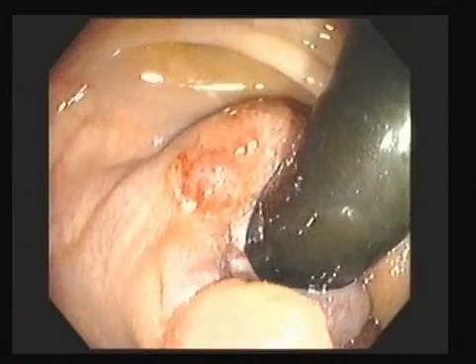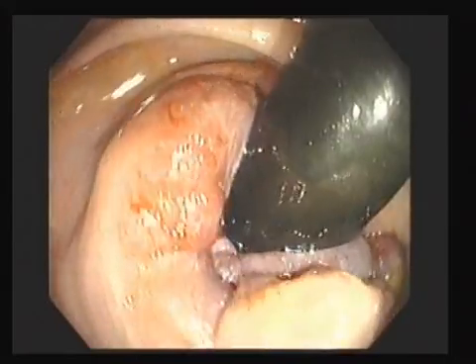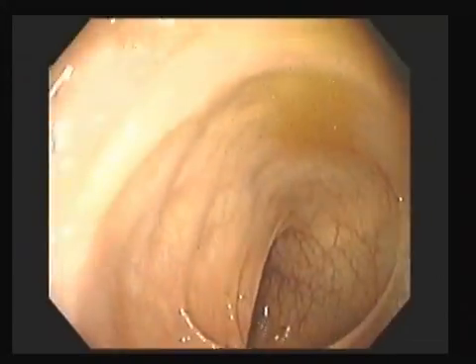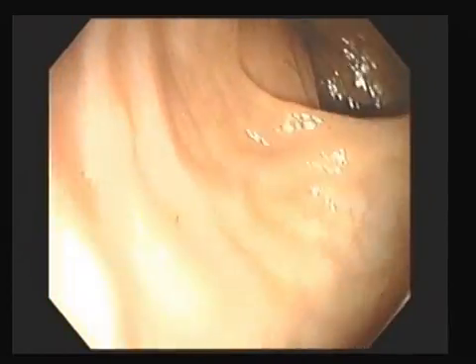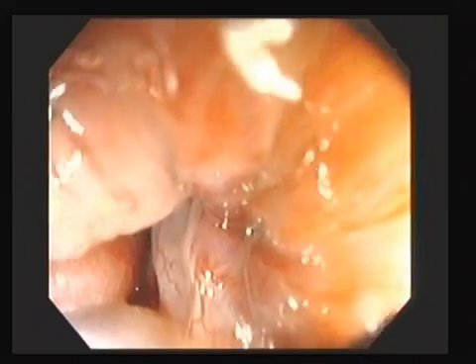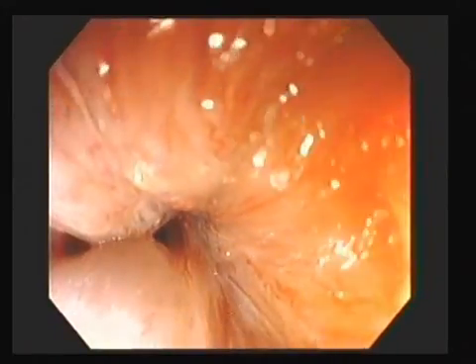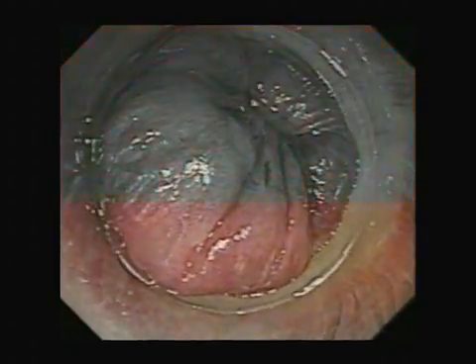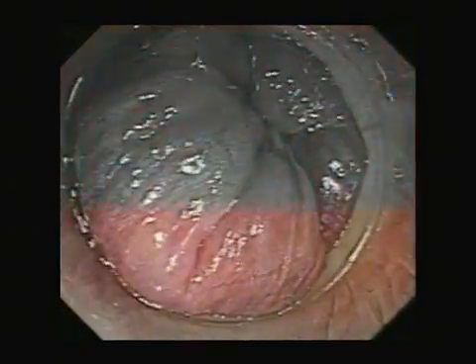Hemorrhoids can be obvious in retroversion, and also partially visible on withdrawal. But much more obvious with a proctoscope in and the patient straining down.